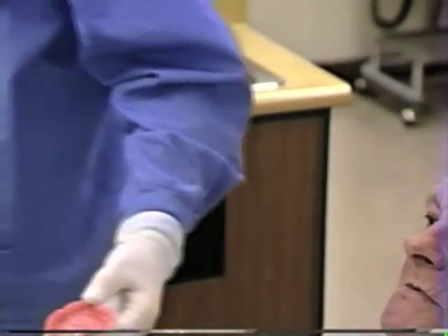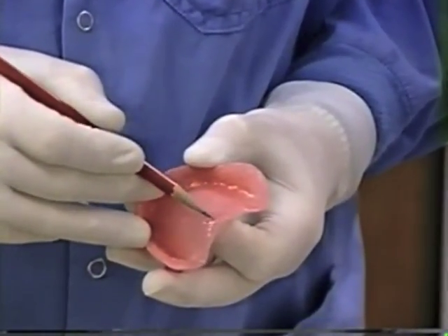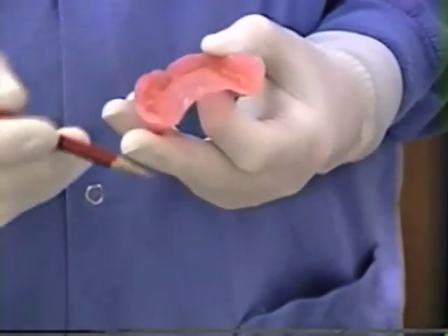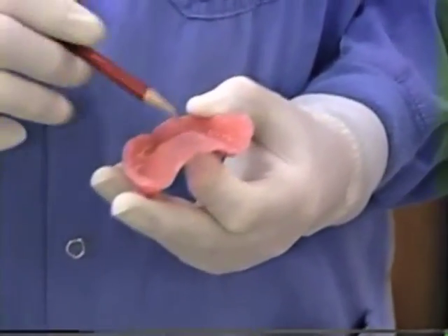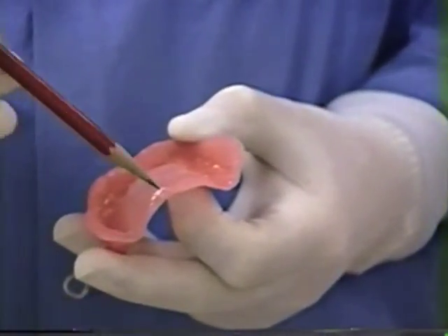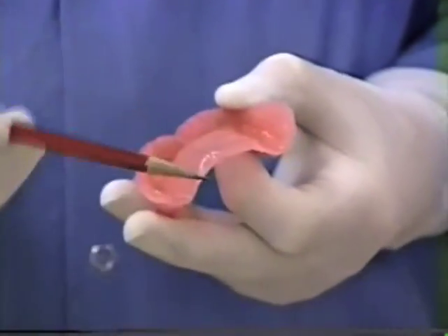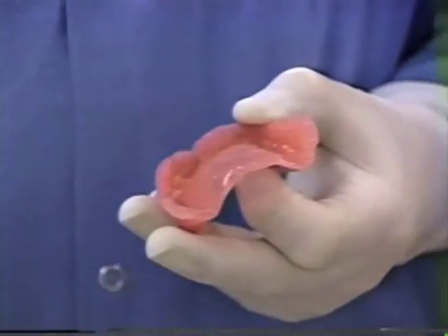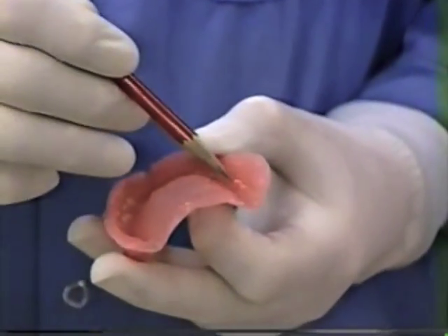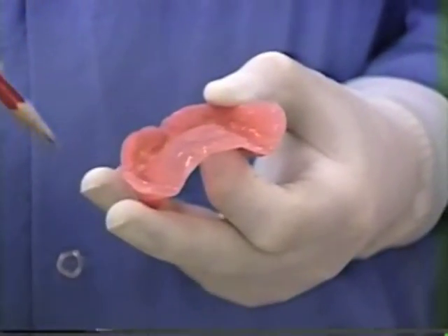That's generally going to occur in the area of the fovea palatine, and on the base plate I can read the fovea palatine here. This base plate is about three millimeters longer than the fovea palatine. What I want to do is test by transferring from this base plate to the mouth a mark to show us exactly where this length is in the mouth. It should be too long at this point — back onto the movable tissue too far. The object is to find out how much of this I would have to cut off to have the posterior end of the base plate exactly coincide with the junction of movable and immovable tissues.